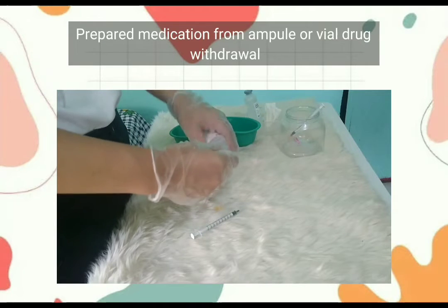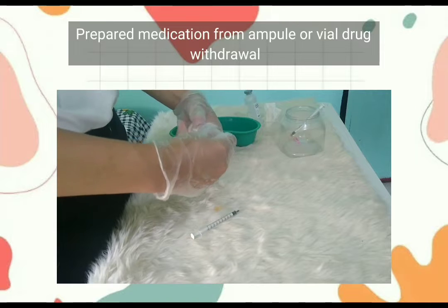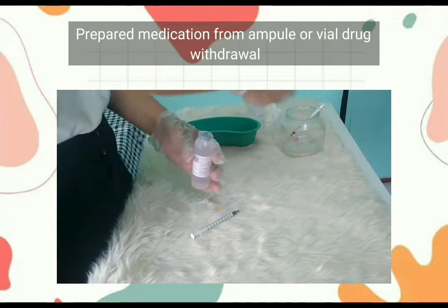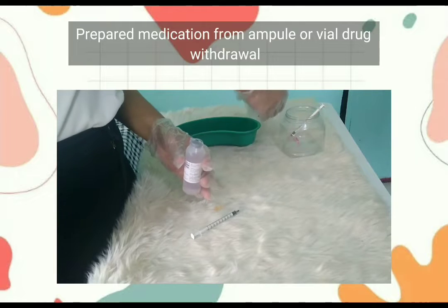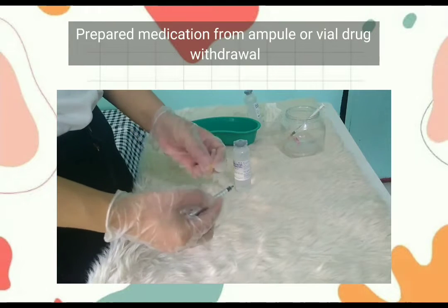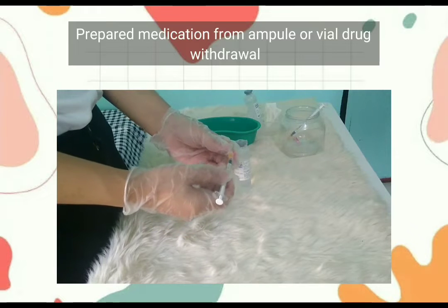And we are twisting this, removing and disposing it. Then putting the cup in the syringe.